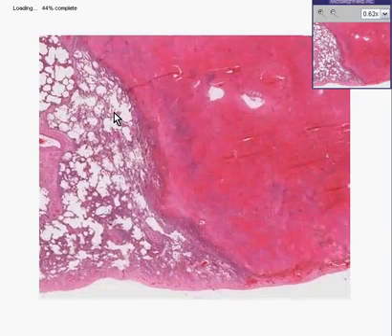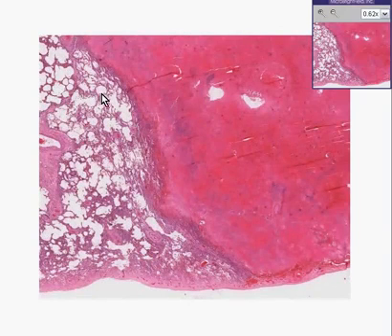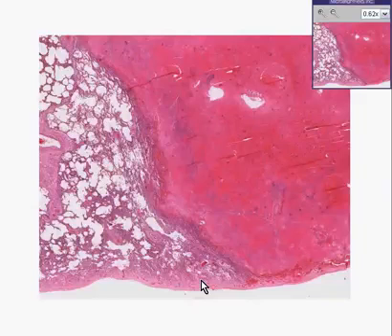And microscopically, you could appreciate the fact that this is lung parenchyma, which is still aerating, but there is a fairly well-defined area now. And once again, this is the pleural surface, isn't it? Infarcts are always, or I shouldn't say always, but how about if I say almost always, peripheral?